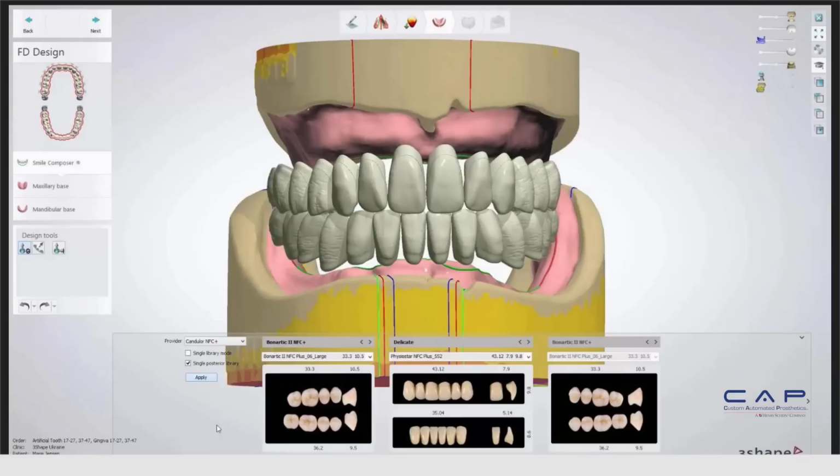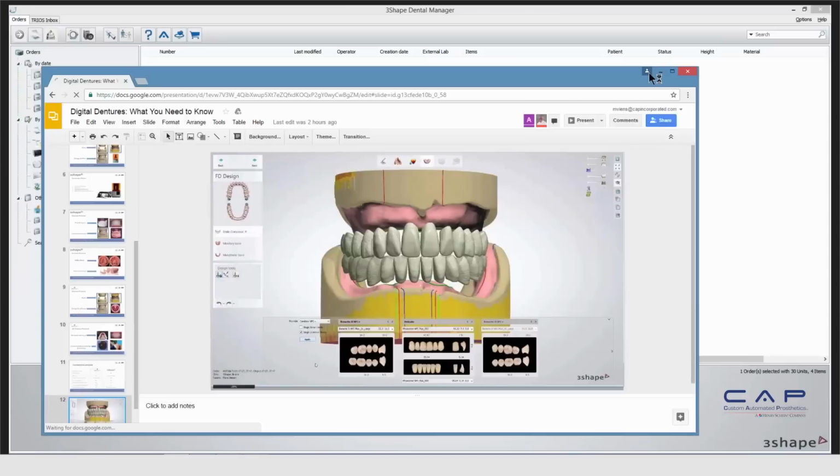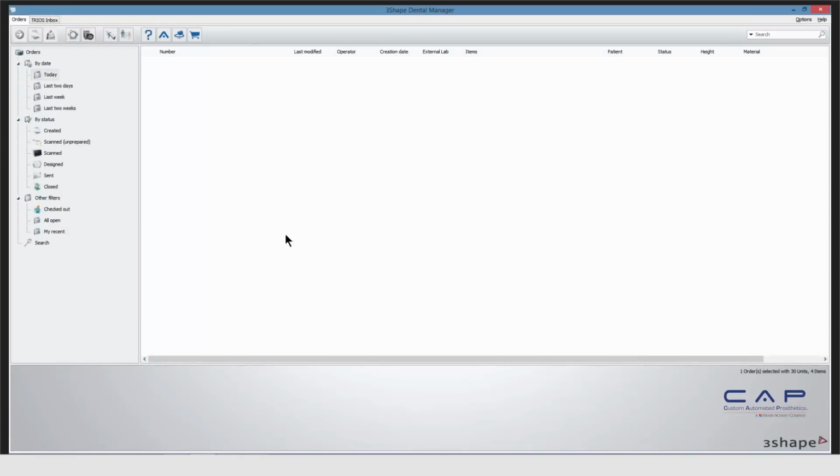All right, guys. So first we're going to go into 3Shape, and we're just going to start from scratch here, where we start with the scanning process, just so you guys can see that. It's a very simple process. There's only 3 scans that we have to do: the upper, lower, and then obviously the wax rim or the bite block, whatever you have.